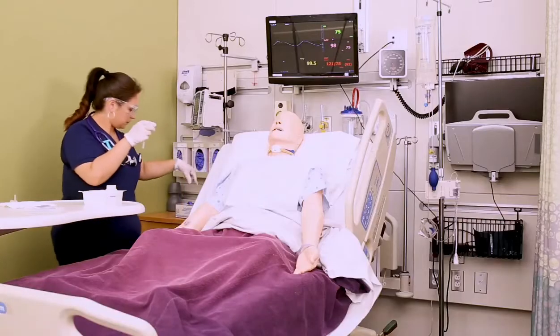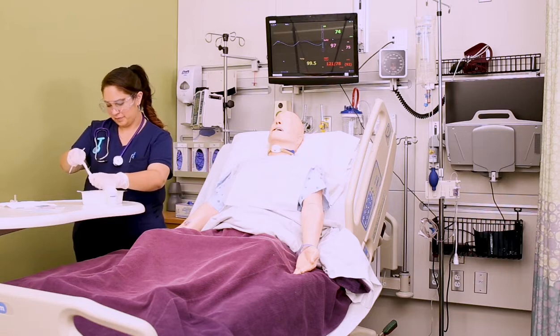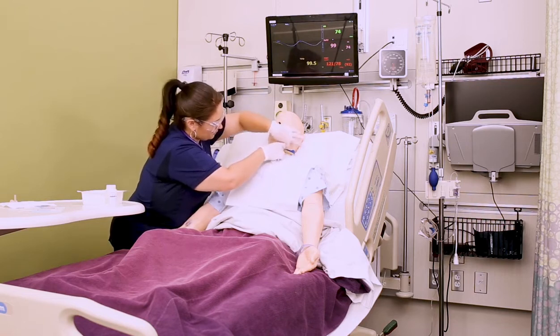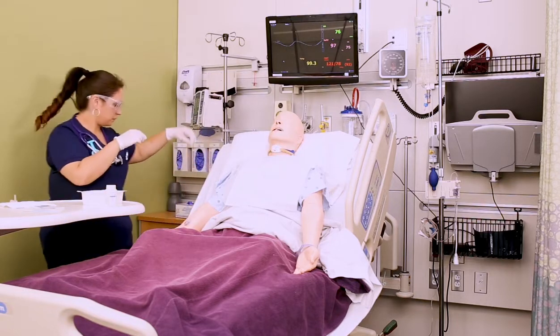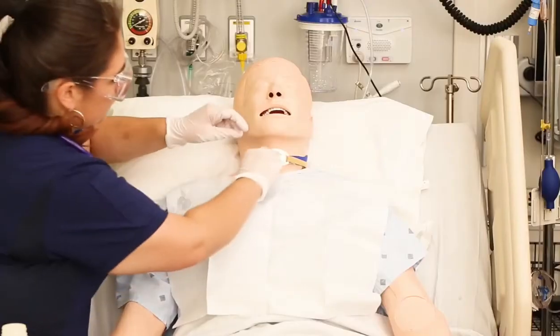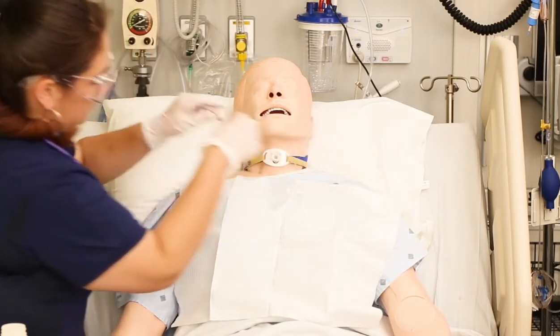And then you're going to bring that piece of gauze up through underneath the flange and just keep repeating that on both sides of the tracheostomy tube itself to make sure that you get all of that nice and clean up underneath the flange. You can also use a dry piece of gauze in the same manner. Just tuck it up underneath and pull it out from the other side to help dry the area and dry around the stoma.